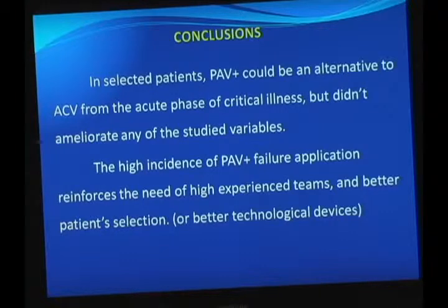Maybe it's too good for some patients, so that they must perform so little muscular effort that they are unable to clearly calibrate the effort. So maybe the rate of help may also be different, not the same for everyone, despite our approach to try to rest the respiratory muscles. And this is my last slide. Thank you for your attention.